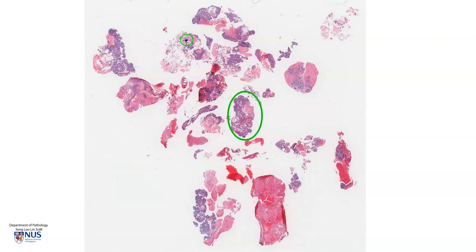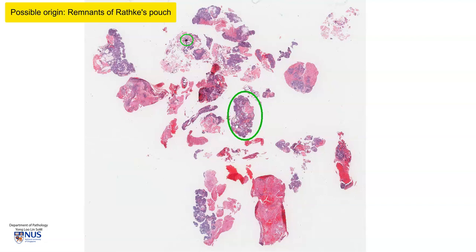These tumors arise in the suprasellar or the sellar region. They are thought to arise from Rathke's pouch, which is an evagination of the roof of the developing mouth. Therefore, the epithelium that forms these tumors resembles developing mouth structures such as the developing tooth.